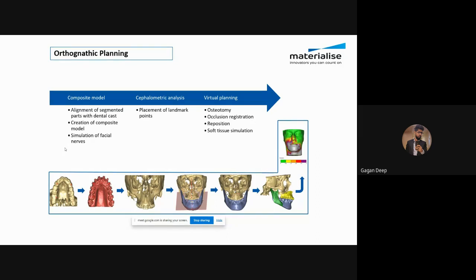Once you have that composite model, you can do a cephalometric analysis. Under the cephalometric analysis, we have a list of all the standard analyses which you generally do, and not only the standard ones, but if you want a customized analysis, that also you can create using the software.